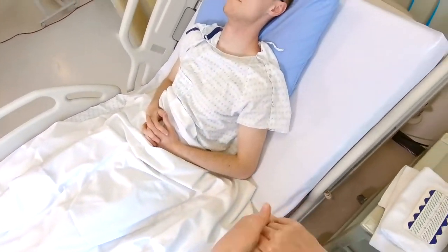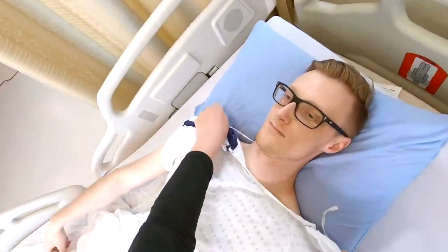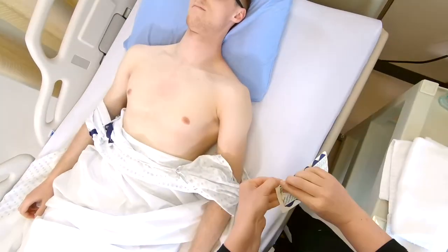Perform hand hygiene. Explain the test to the patient and have them lay as flat as tolerated to obtain the best tracing possible. Expose only the required areas of their body, drying any skin if wet or diaphoretic.